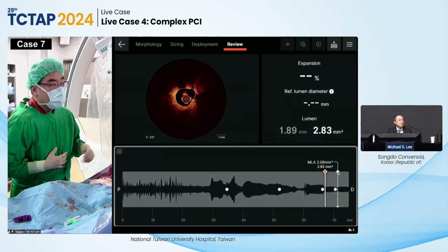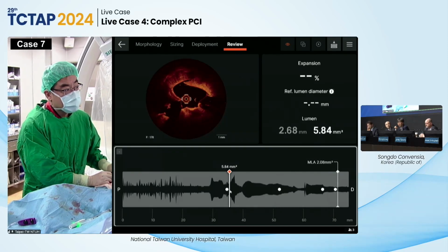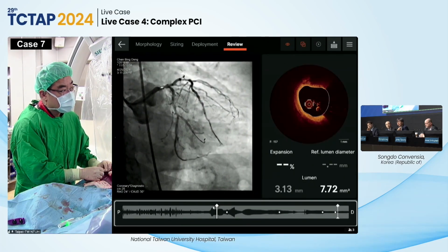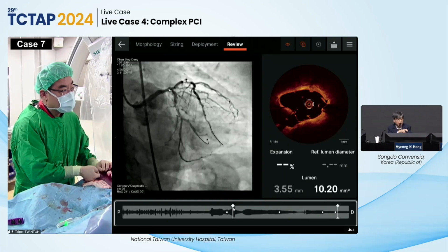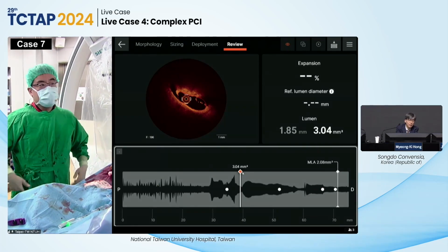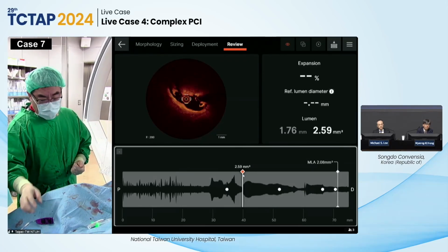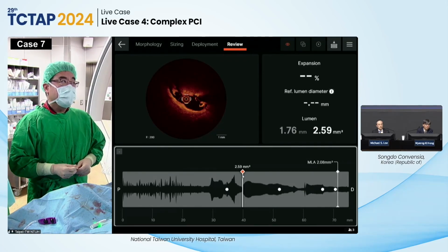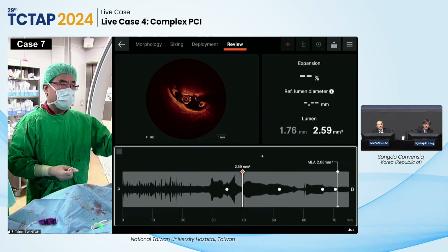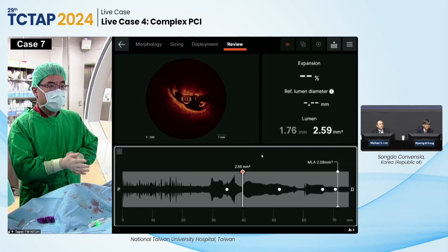Right. In the OCT examination, we already found that there is a lot of calcium in the lesion. So in the next examination, we want to know about the sizing of the vessel, rather than the severity of the calcium. Despite my wish to have just one stent, my feeling, reviewing all this process, is that we will end up with two stents in the left main bifurcation. I think it will be a culotte configuration, but before that, we will do IVL on both. The distal circumflex, I will also stent in this one session.